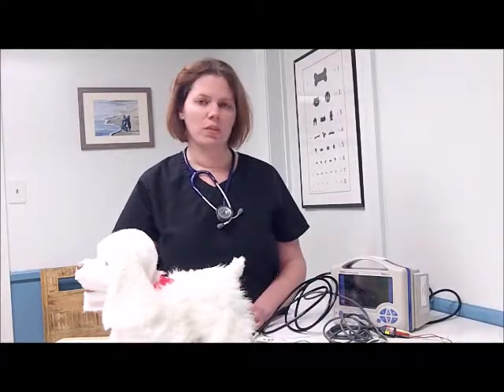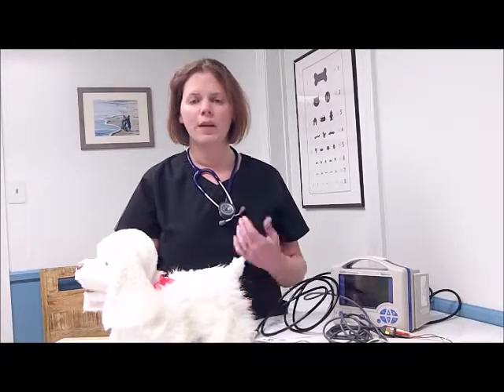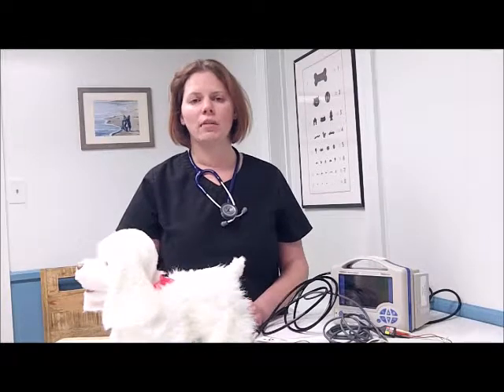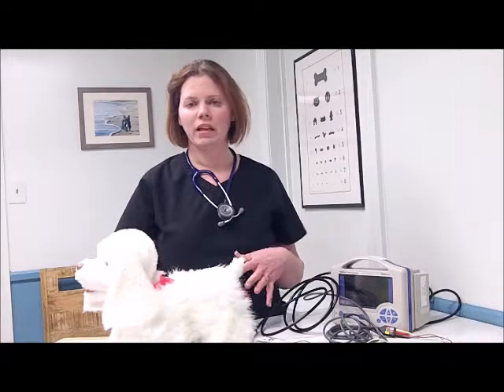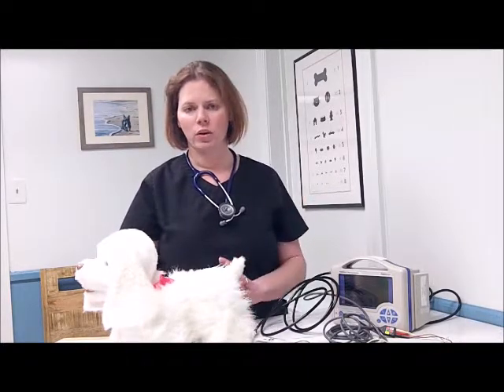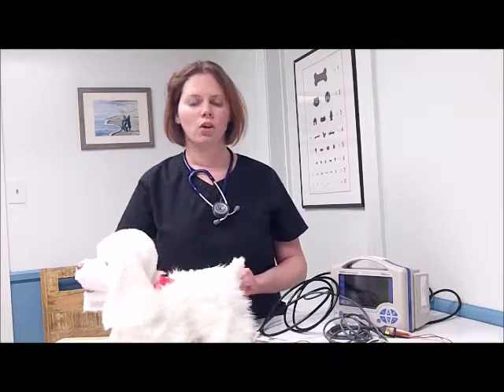Some of the things that you may notice with the heart rate are changes in the actual rate. You have something like bradycardia, which is a slow heart rate, which can be indicative of an anesthetic level that is too deep. You can have a very high heart rate, or tachycardia, which can be indicative of our patient being too light. This also occurs in the first planes, the first stages of anesthesia, as the patient is going under. You find normal to high normal heart rates. During anesthesia, you want a nice steady heart rate and a normal rhythm.